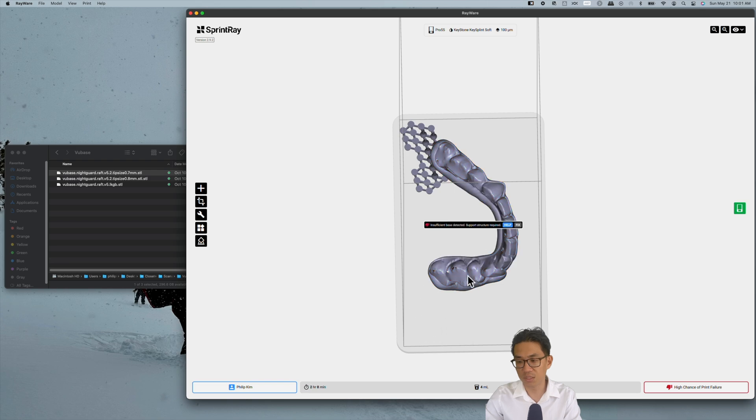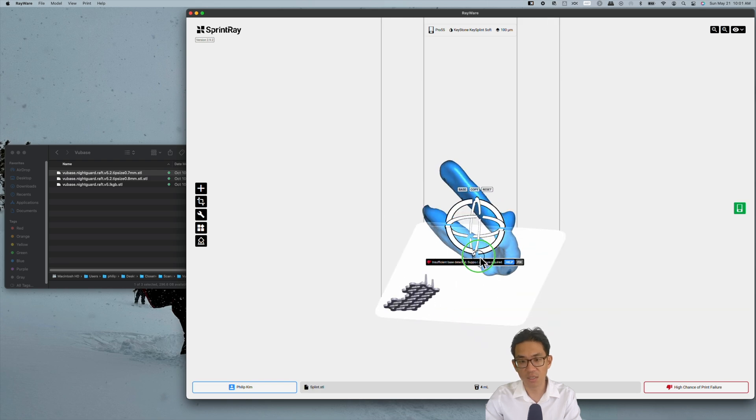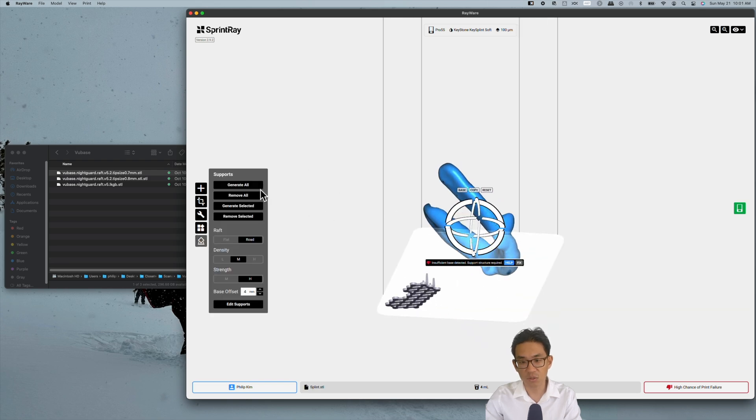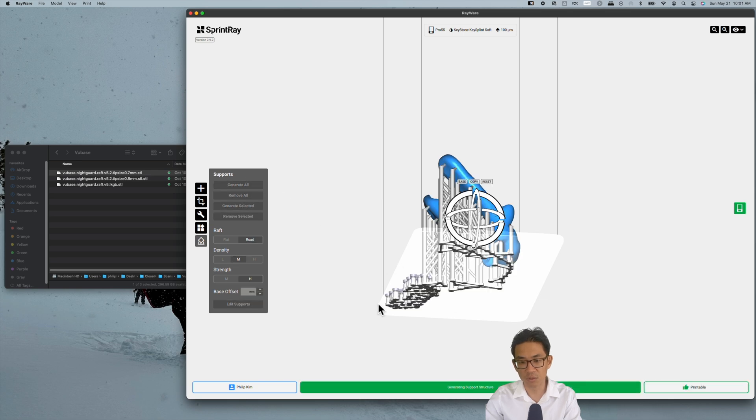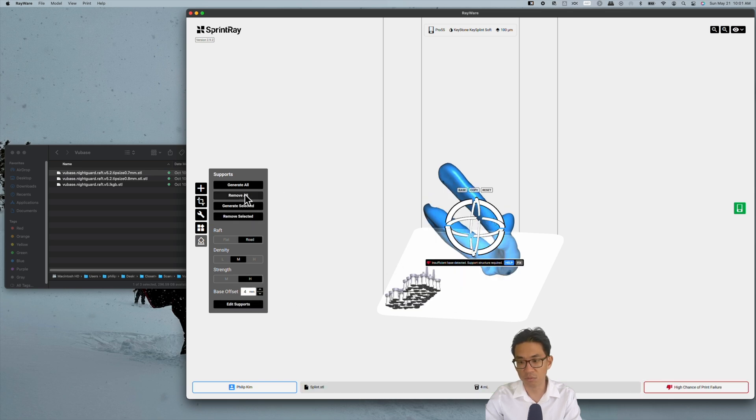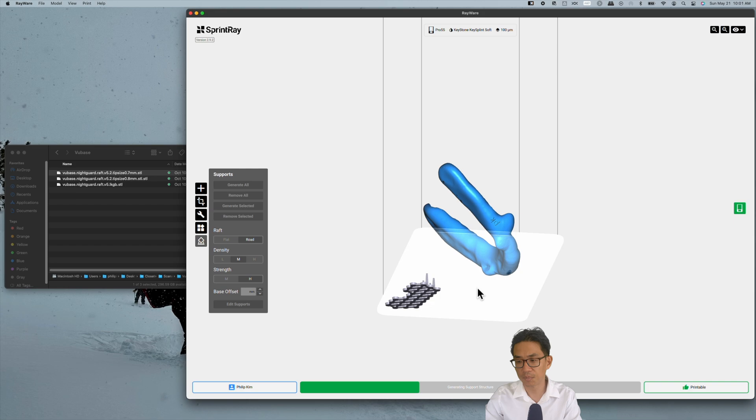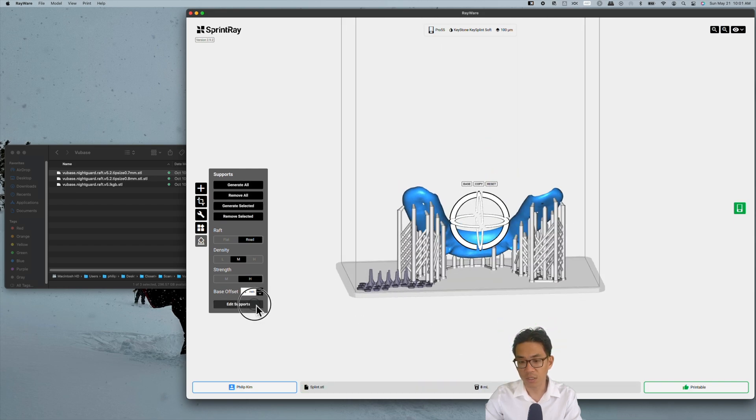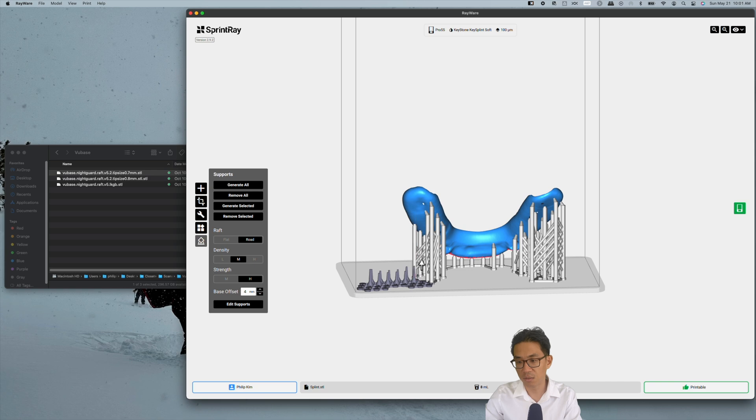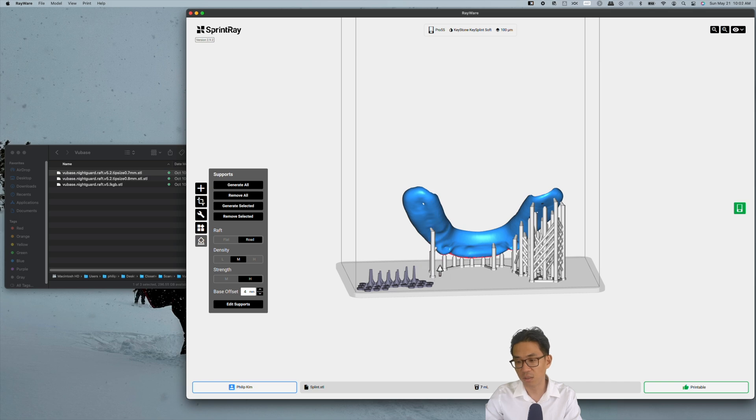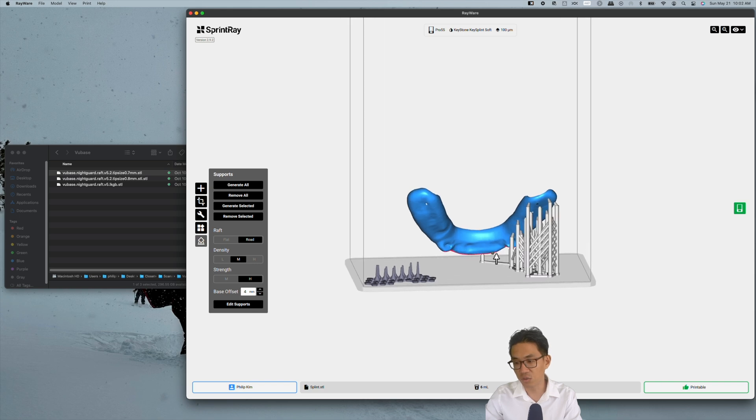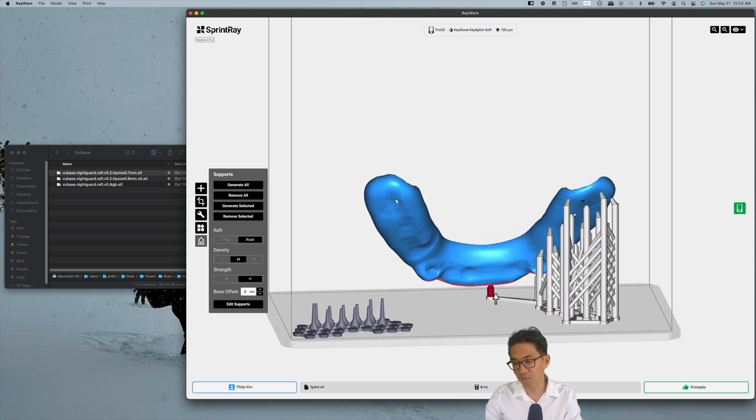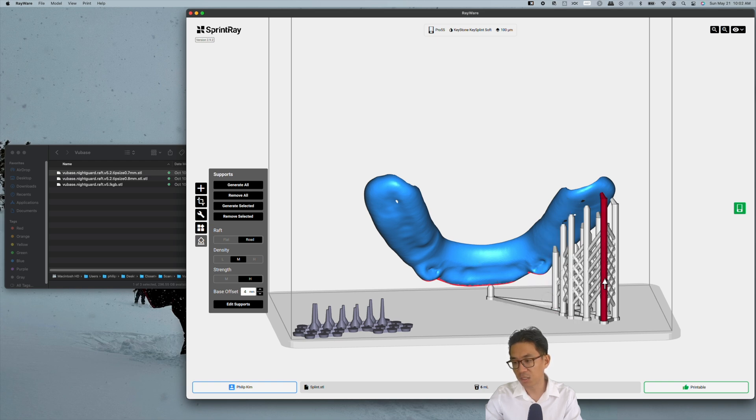You generate your support. Hit generate selected just for this night guard. What you need to do is go hit edit supports and delete all these supports that are in the way causing issues post-processing in terms of polishing and dialing in the occlusion. What you need to do is leave one single support so that it keeps the splint off the print bed.